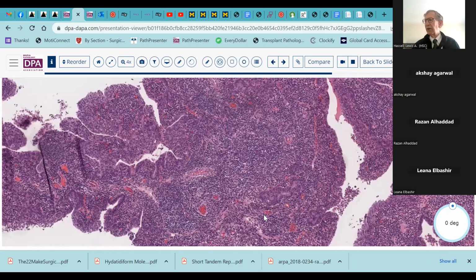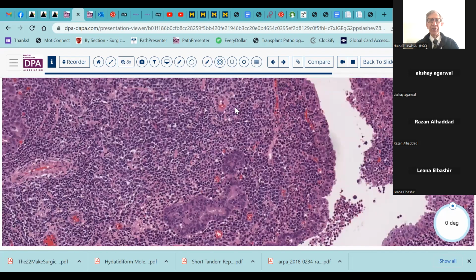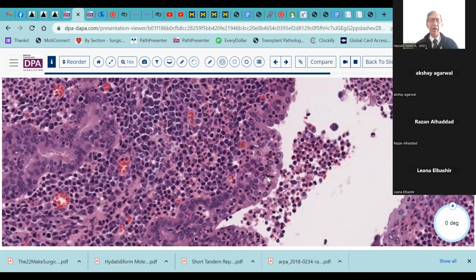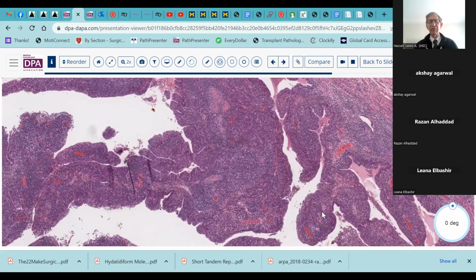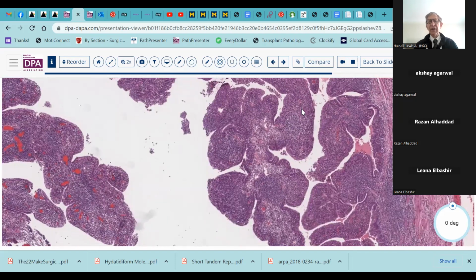And as you know, that can set a person up for infertility, as well as other sorts of problems and challenges with their reproductive issues, such as ectopic pregnancy or those sorts of things. Because this kind of inflammatory process, particularly if it becomes more fibrinoid, can lead to synechia or scarring of the tube, hydrosalpinx, poor transit, essentially, of the gametes that set a patient up for potentially developing an ectopic gestation.